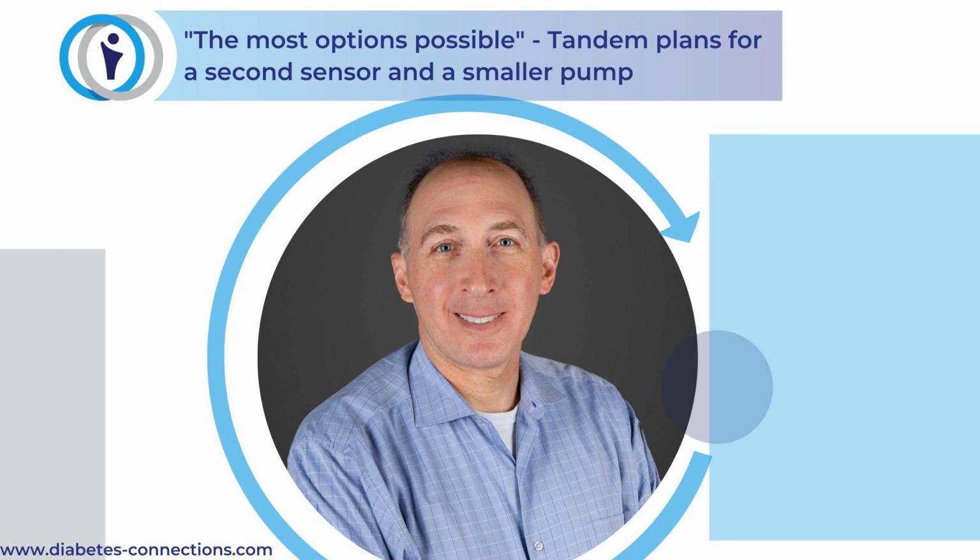We were just talking about Basal IQ. One of the questions I get all the time is about lowering the range at which Control IQ, in whatever mode it's in, will try to keep you. Tidepool Loop was recently approved with a low of 87. So there's some FDA precedent now. Can you talk a little bit about if there are any plans to move ahead to something that aggressive?